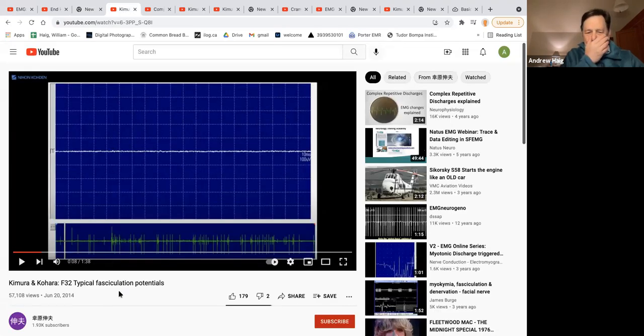These are fasciculations. And if you look across the bottom of Dr. Kimura's screen here, you see this motor unit. This is a very long time period, firing kind of randomly all by itself. And now let's listen and watch. You put the needle in the muscle, you step away, you let go of the needle, tell the person to relax, and you hear this. The motor unit, but they're not making it happen. It's not firing based on people controlling. This is a motor unit, and it can be normal looking.